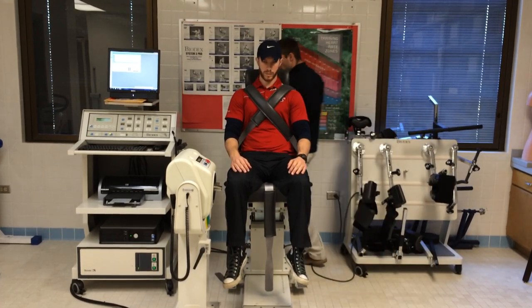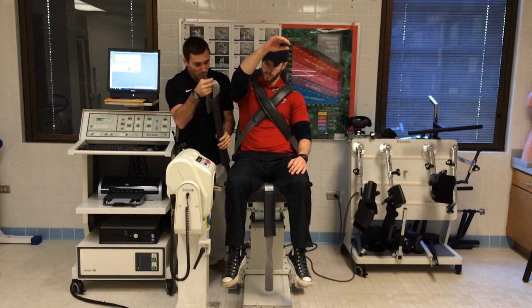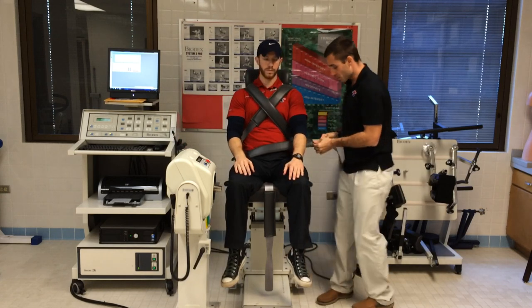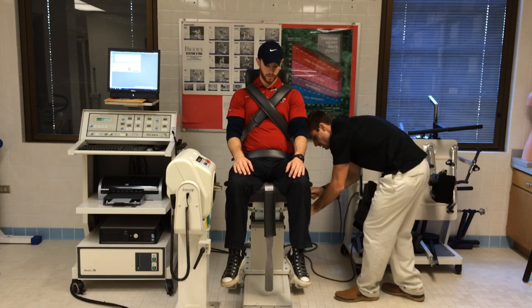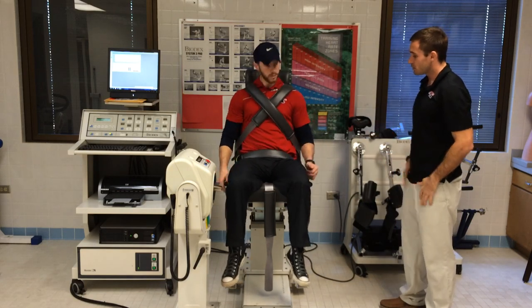Next thing we're going to do is his waist strap. We take this strap here by the side. We're going to pull it over his lap, and it's going to go into the clasp right here on the chair. Push that through. Same concept. We want it tight, but not debilitating. So again, does that feel okay? It's not hurting you? Okay, good.